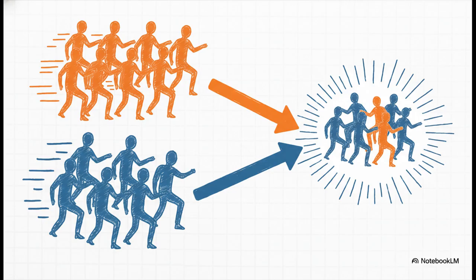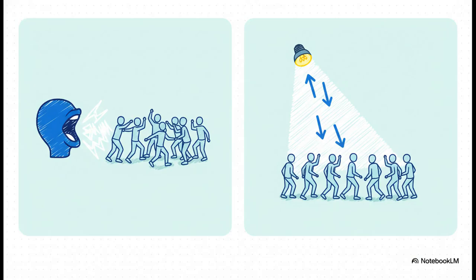That moment, that's the echo we've been waiting for. Now that big DJ shout, the spin echo, isn't the only tool in the box. There's a quieter, more subtle technique called a gradient echo. So instead of a loud shout, picture this as a clever lighting effect. It's like the light tech is playing with the magnetic fields to first speed some dancers up and slow others down, and then just reverses that effect to bring them all neatly back into sync. You get the same echo, just without the big 180-degree shout.